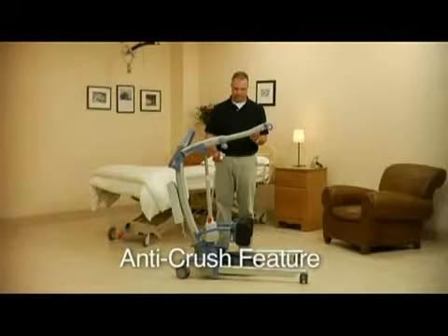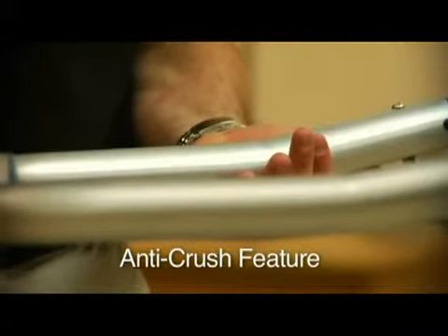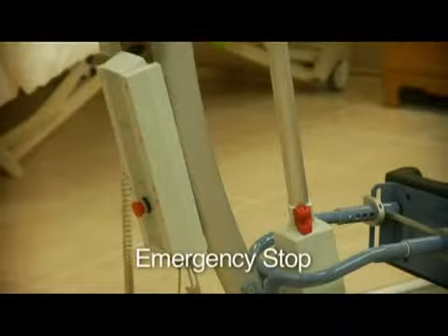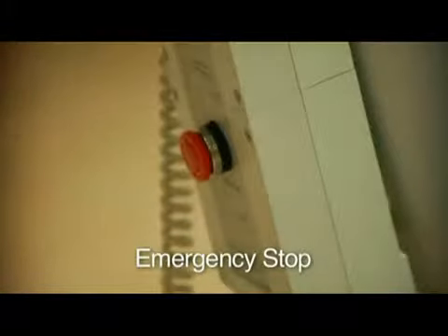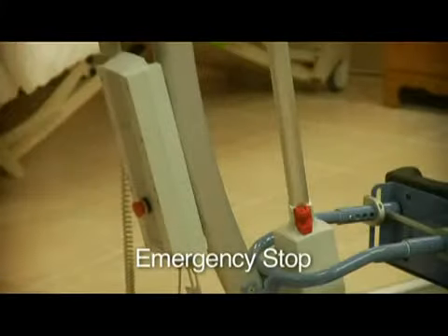The S440's anti-crush feature prevents the boom from lowering in the event it encounters resistance. The emergency stop button allows you to disconnect all power from the unit. To reactivate the unit, turn the emergency stop in a clockwise manner, and power will return to the unit.